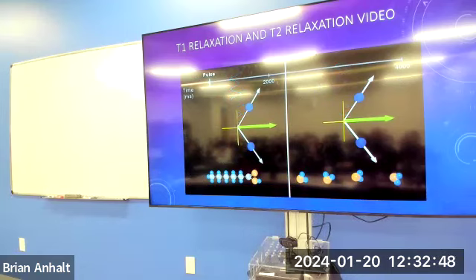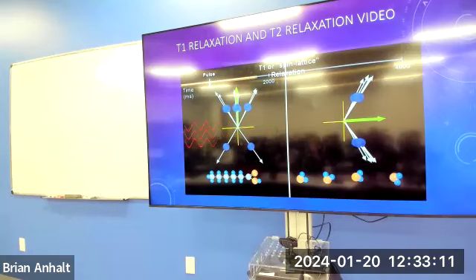If we wait a sufficient amount of time, the protons will move apart in a T2 or spin-spin relaxation, and the transverse magnetization will decay. The protons associated with the free fatty acid, being relatively fixed in position, decay rapidly as the spins push away from one another. They also give up their absorbed energy more rapidly as they fall back to baseline in a T1 or spin lattice relaxation, depositing heat energy into the surrounding tissues and regrowing the longitudinal magnetization. On the other hand, the protons in the freely flowing water can hold on to their energy and continue to spin together in phase, thus maintaining the transverse magnetization.